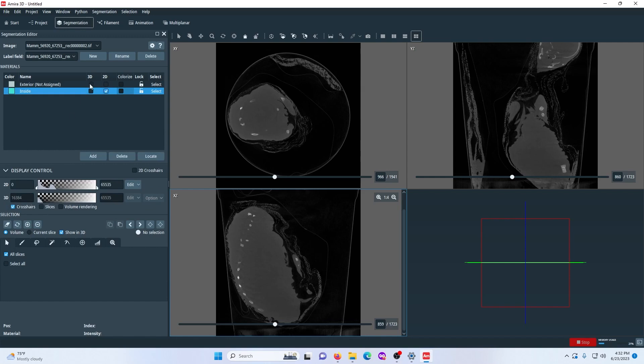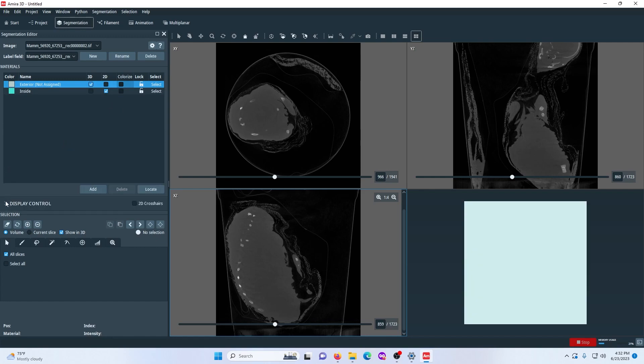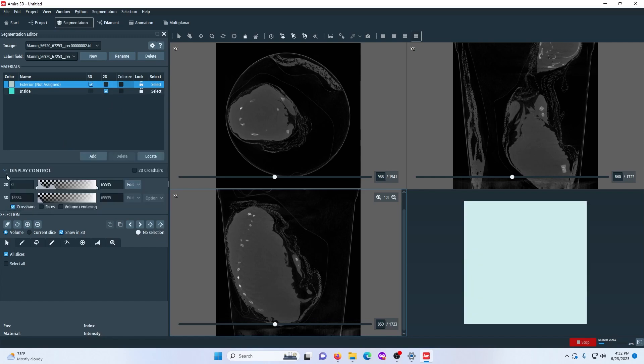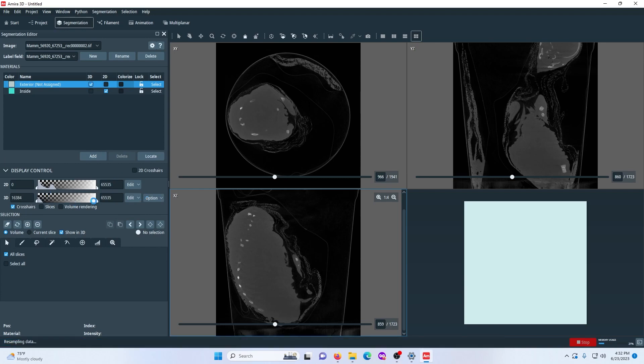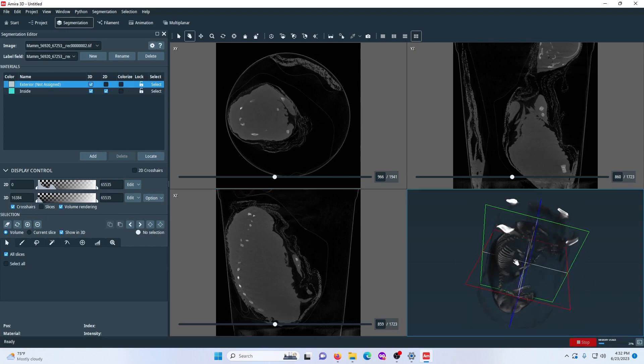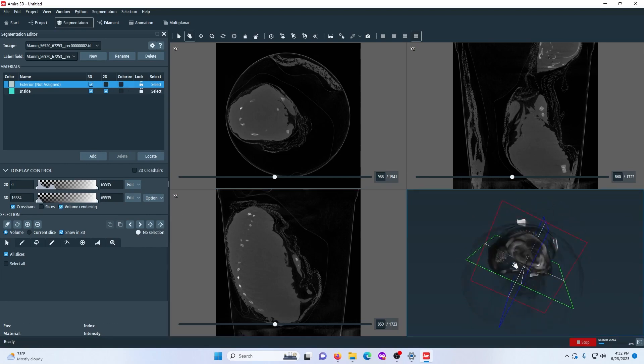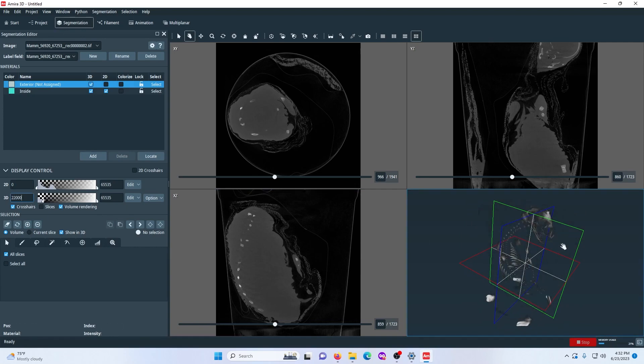Well, first of all, let's turn on the picture itself. Go into display control. It's right here on the left. I pointed, but you see where it is. And then volume rendering. And depending on what you're looking at, you want to set these ranges, the range right here. And I would play around with it a bit. I'm only looking at ossified, like bone. Basically I'm only looking for bone.